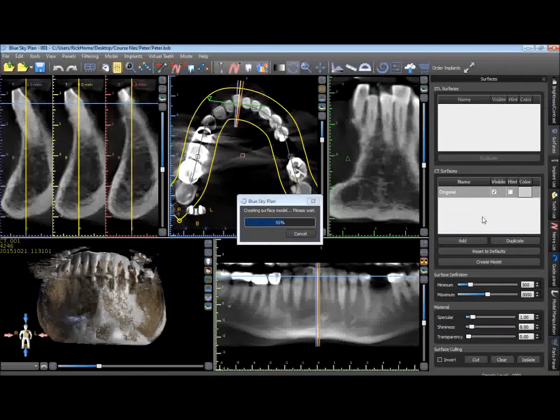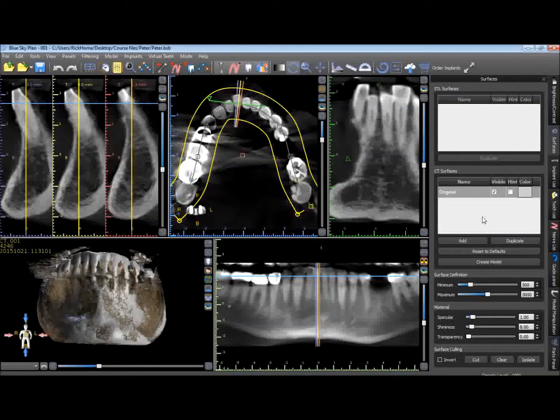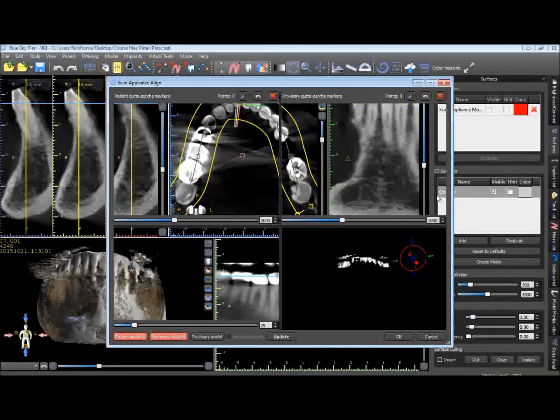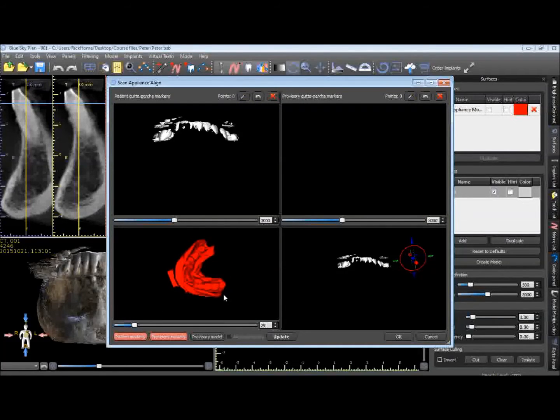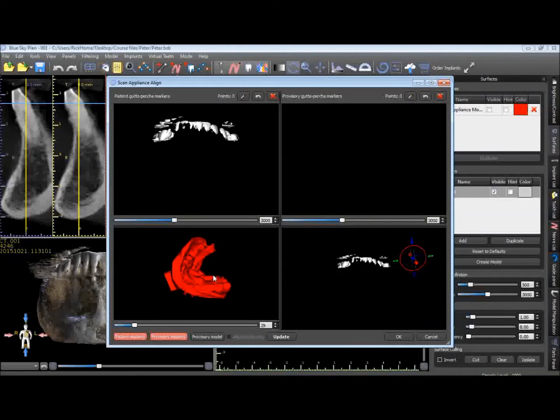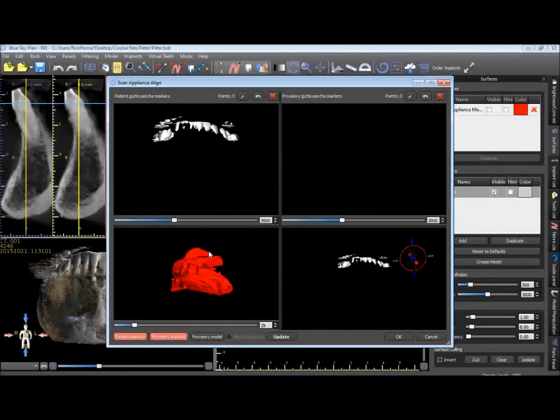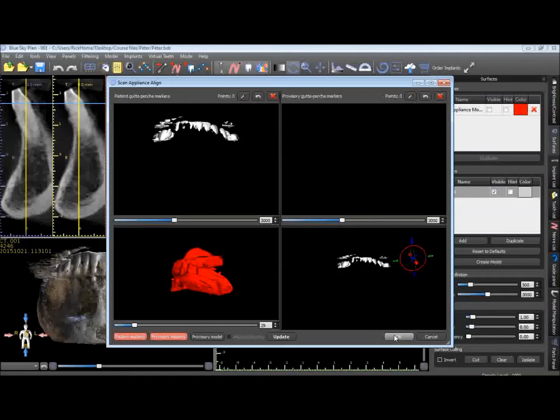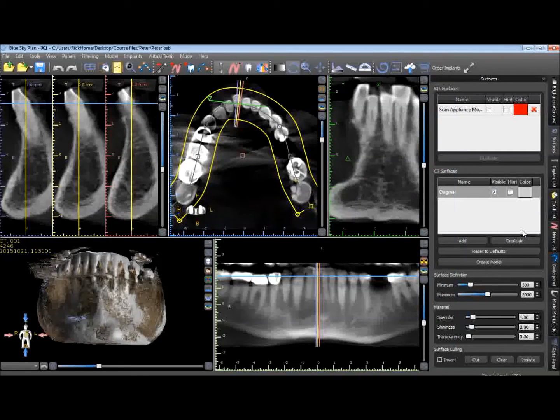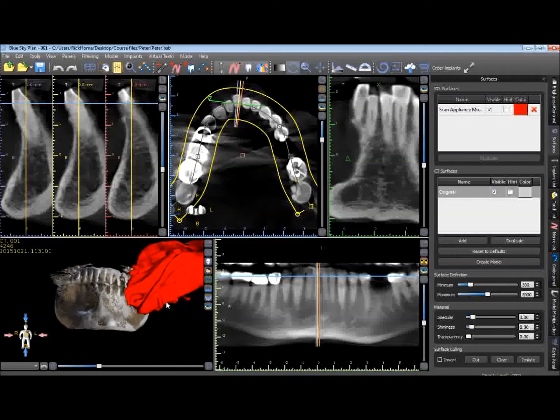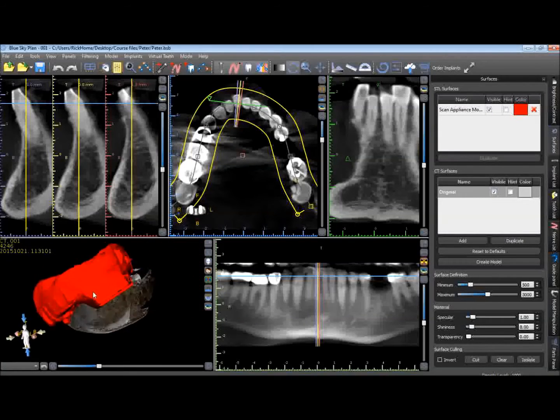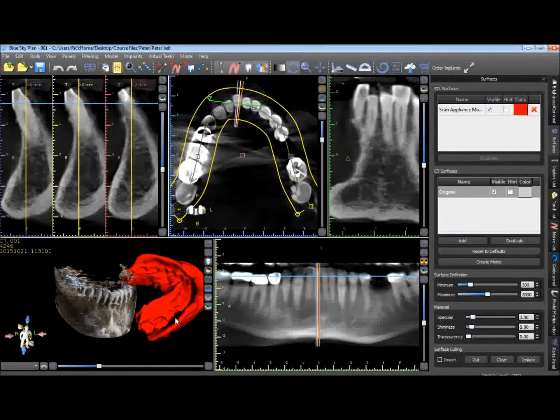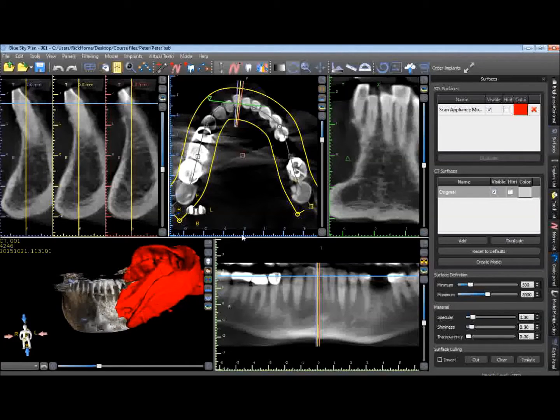And what Blue Sky Plan is going to want to do is actually align this impression to the patient's teeth from their jaw scan. That's not what we're trying to do here with this. We're just simply bringing in this DICOM dataset into Blue Sky Plan. We're just going to go ahead and OK. And it's just going to arbitrarily place that impression somewhere in space. You can see it's actually kind of overlapping the jaw scan here. But it doesn't matter.